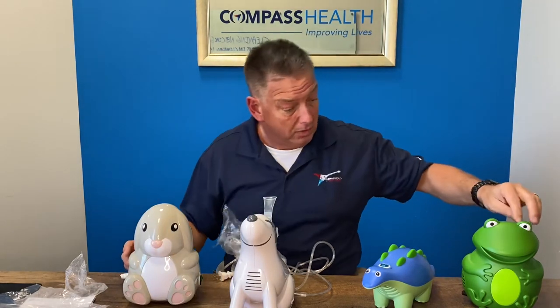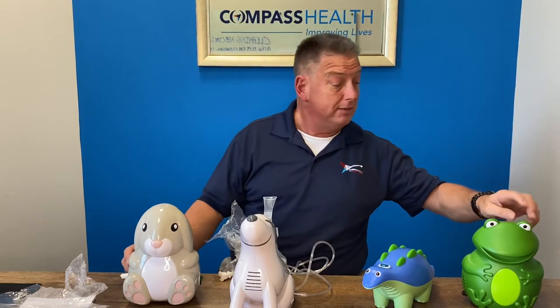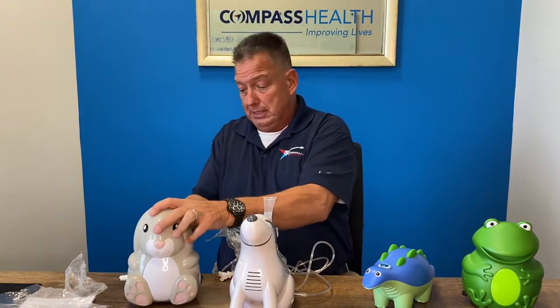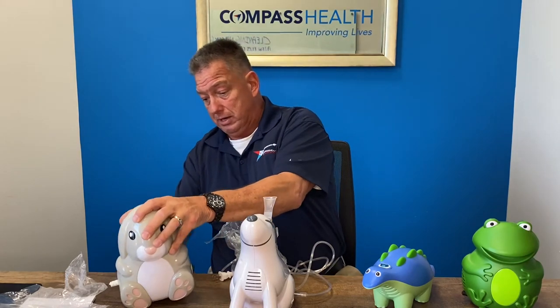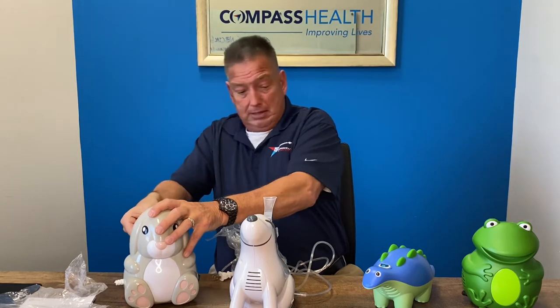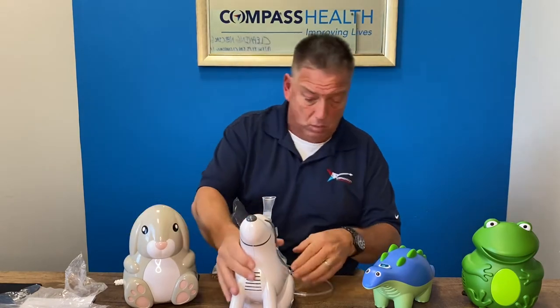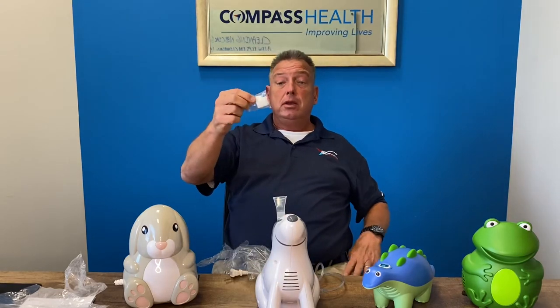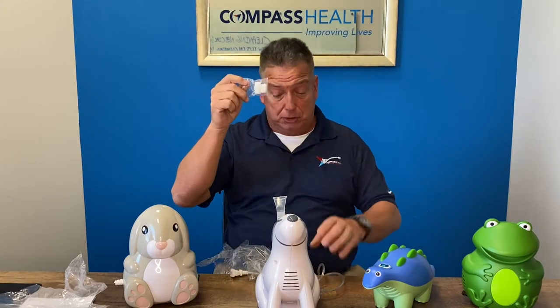And the frog has it on the back of his head. All the filter housings are located right on the back and the bottom. The same goes for each of the other models. Each model will include five additional filters.